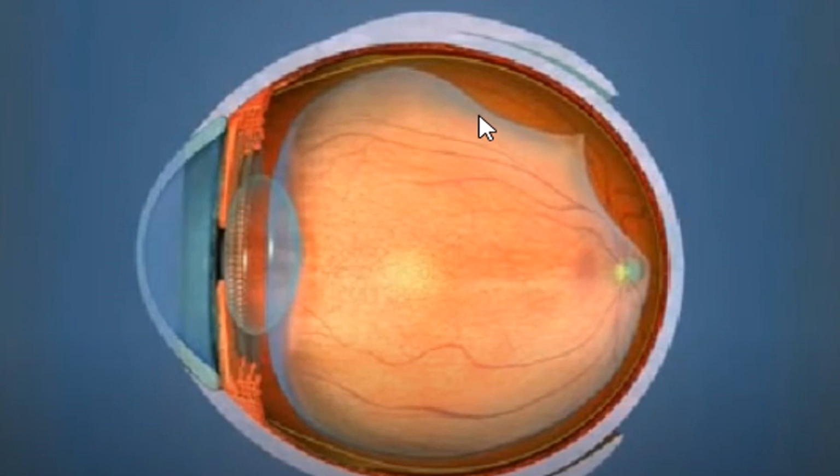The vitreous is transparent, as we see here, and the posterior vitreous detachment happens with aging normally. It's not a pathological process, it's a normal aging process. But during this normal aging process, we keep praying that it ends normally without complication, because you remember what I told you, that vitreous is the bad neighbor for the retina. We just pray that vitreous goes away from our house without harm, okay?